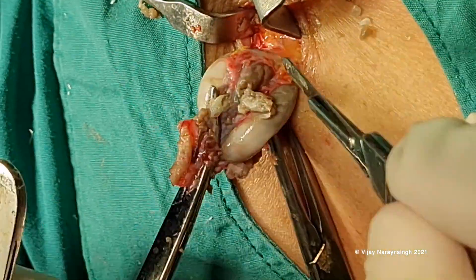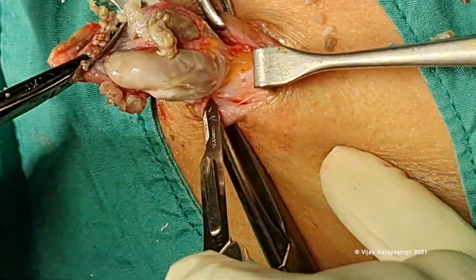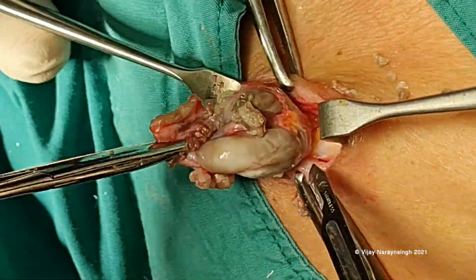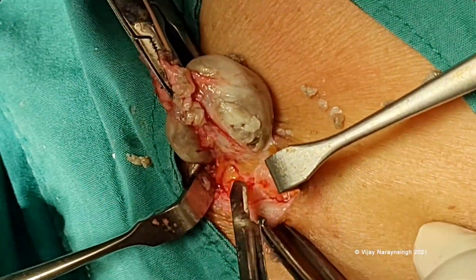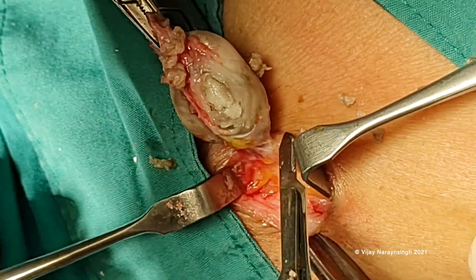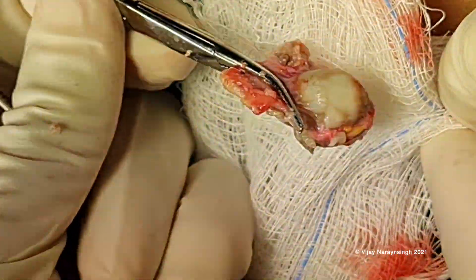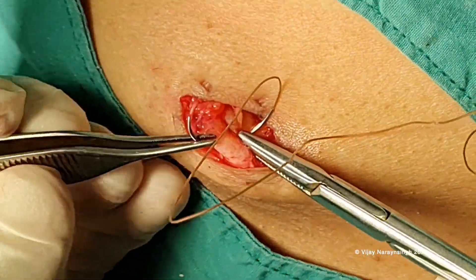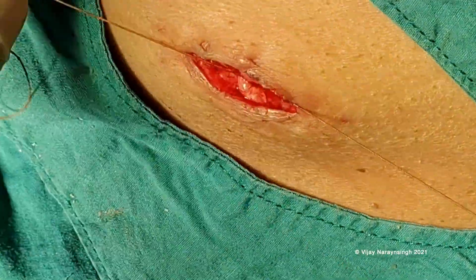We always stay close to the cyst wall and try to minimize the amount of fat on the cyst, because that minimizes bleeding. Using lignocaine with adrenaline also helps minimize oozing. In some cases, I just approximate the subcutaneous tissue with a single stitch.